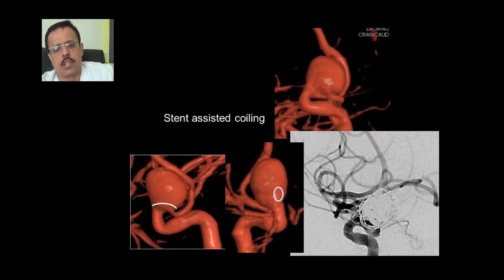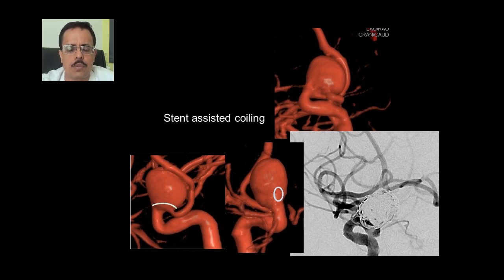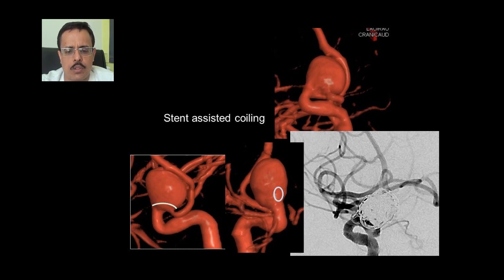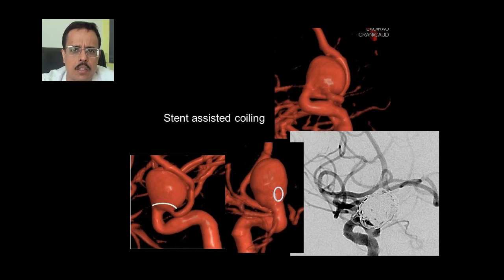To show a case of stent-assisted coiling: there is a large fusiform aneurysm of the ICA where you can see the artery is entering and leaving the aneurysm at separate points. We placed a stent from one arterial segment to the distal arterial segment to construct a new artery in between. The lines in the lower figure show where the stent was placed within the aneurysm. We then coiled the sac, and you can see the post-coiling image. While this method is quite safe, recurrence rates in large aneurysms with stent and stent coiling are still significant.